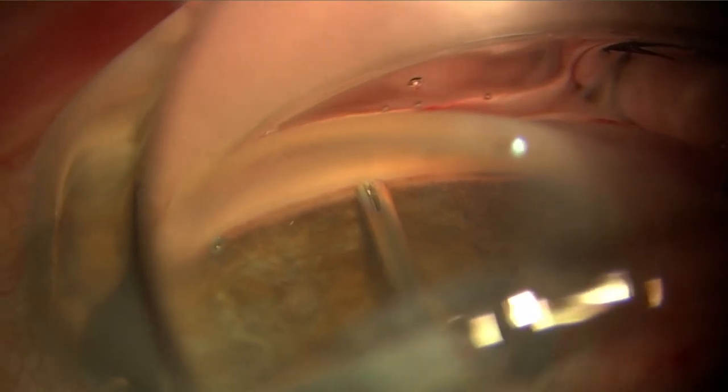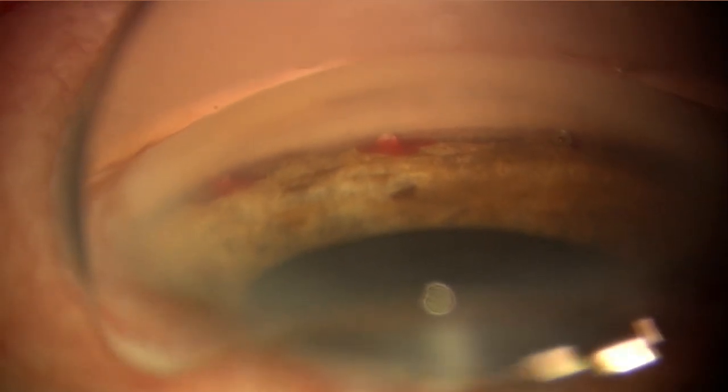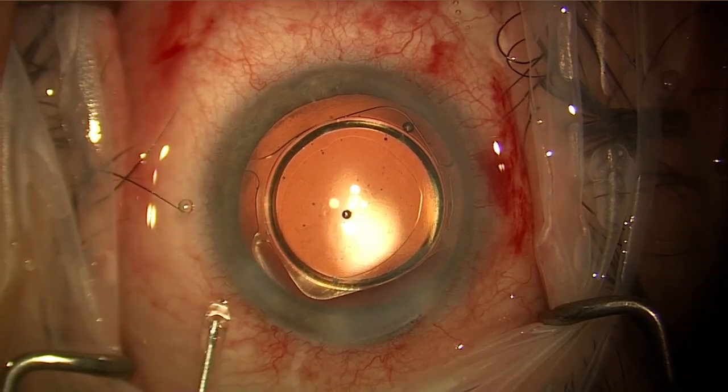Again, well positioned. The stents fire very gently off this new injector system, and therefore there is much less of a jerk. The third stent is also fired into a good position, and you can see the 3 stents here, a couple of clock hours apart, and we get this nice blood reflux through the snorkel of at least a couple of them.